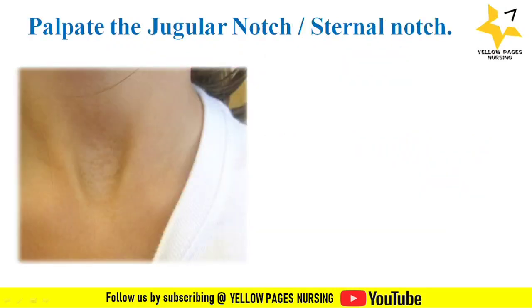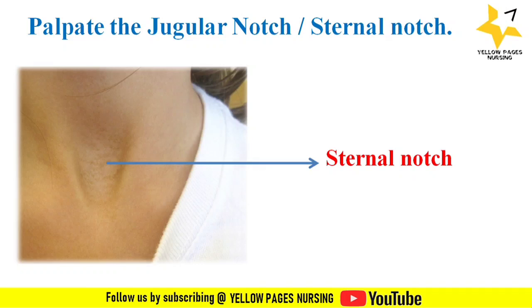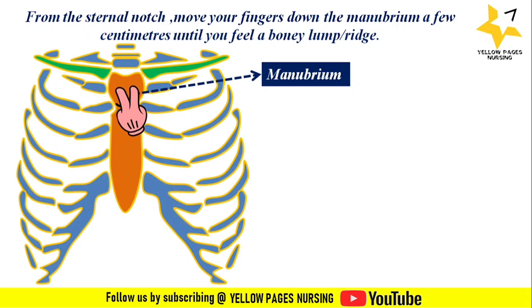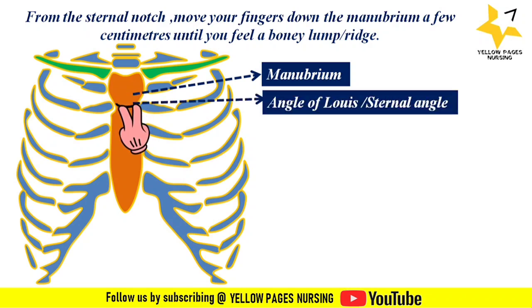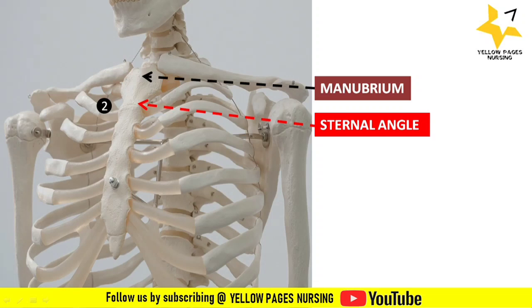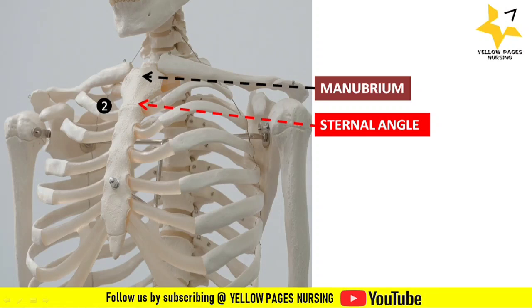Palpate the jugular notch, or sternal notch, which is above the sternum as shown in the image. From the sternal notch, move your fingers down the manubrium a few centimeters until you feel a bony lump or ridge, which we call the Angle of Louis or sternal angle. In the picture we can clearly see the sternal notch, below which is the manubrium, under which we find the sternal angle.